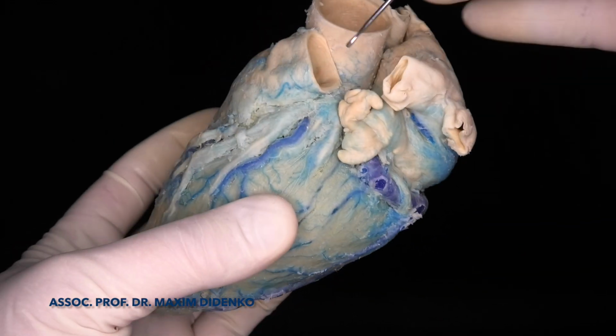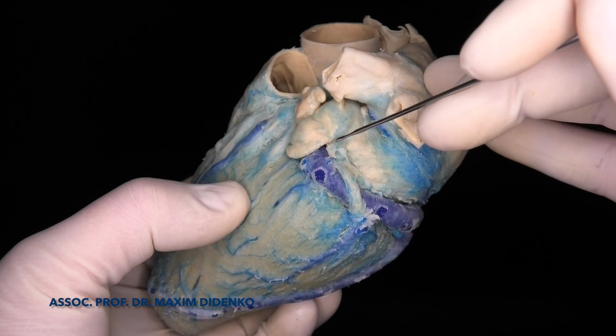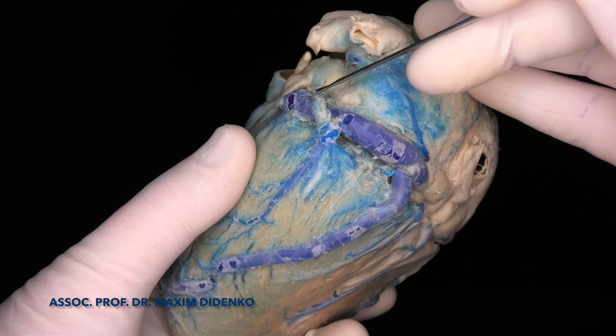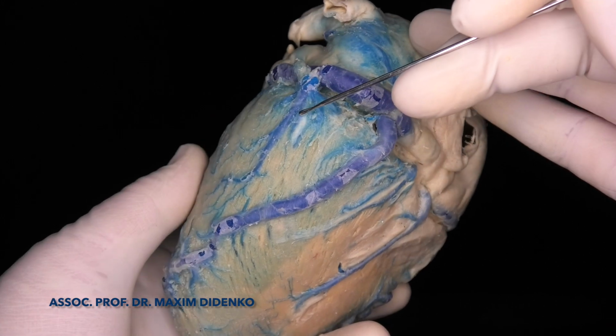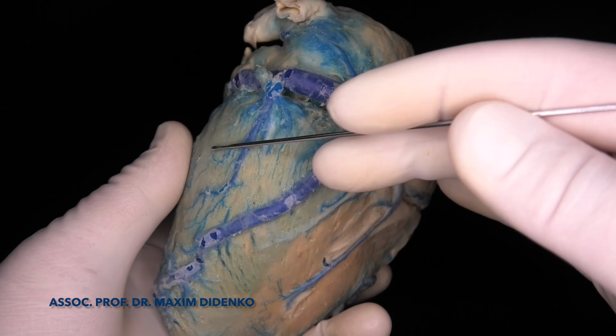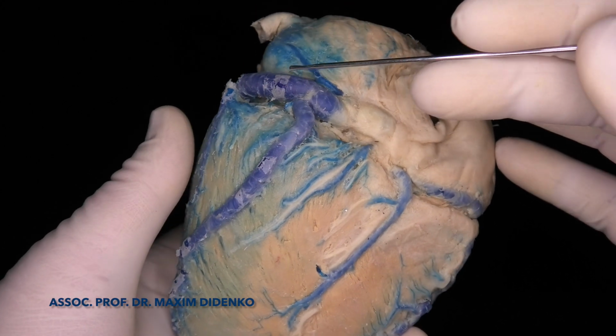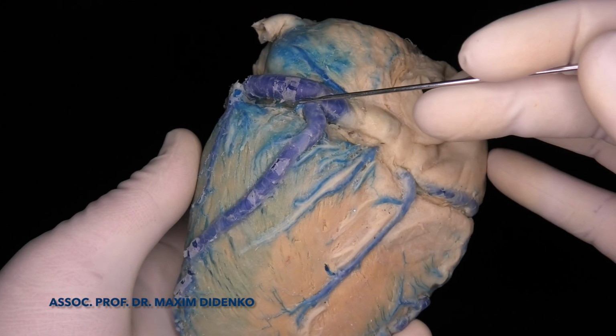This is a circumflex artery here, just below the left atrial appendage, and then we can see it supplies the lateral wall with the obtuse margin artery, and then it goes to the posterior wall.